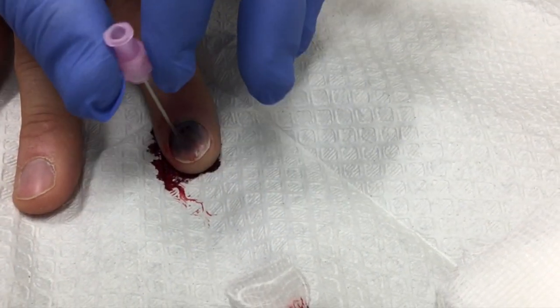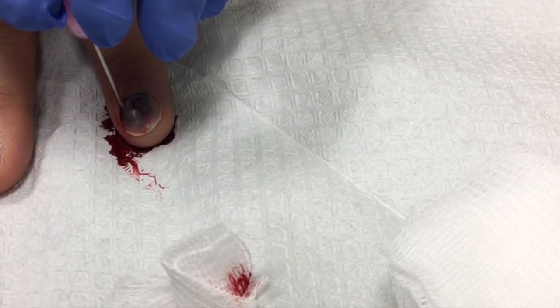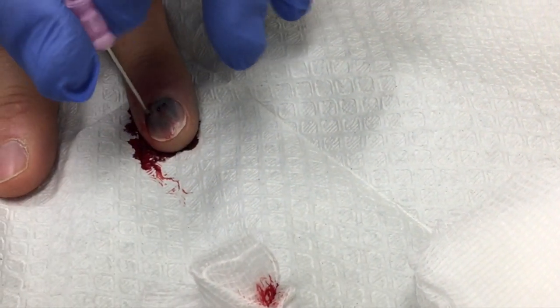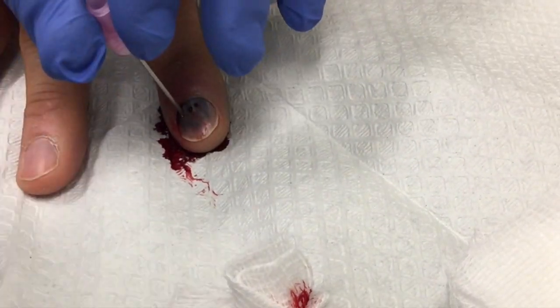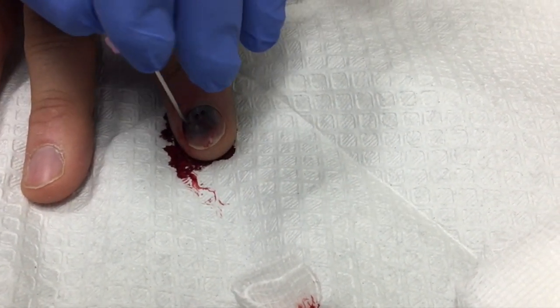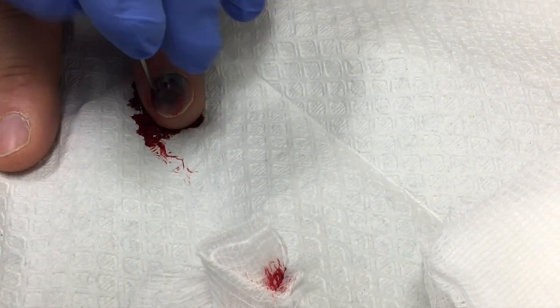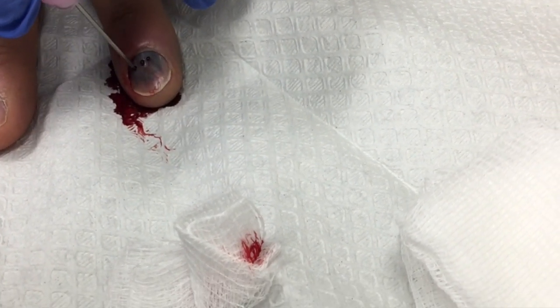Going slower here on this one. Your nails aren't very thick so we go through pretty easily — going really slow. They make a little drill specifically made for this with a flat bottom, not a sharp bottom. Okay, a little blood coming — you okay? Yeah.